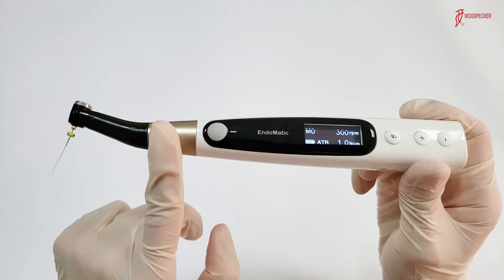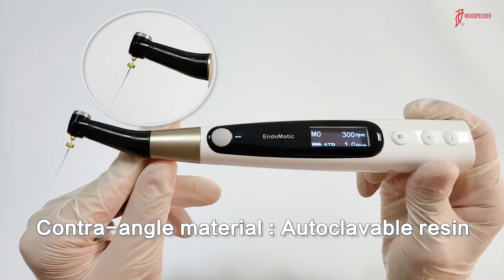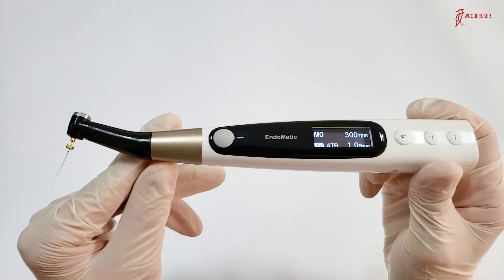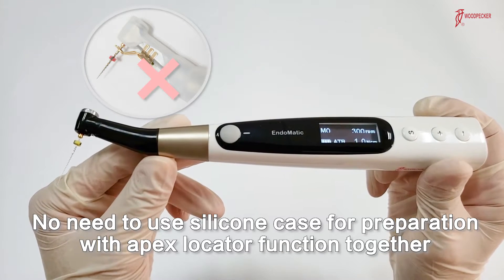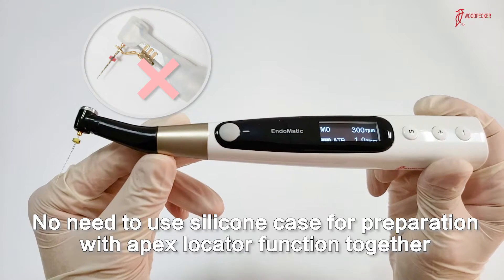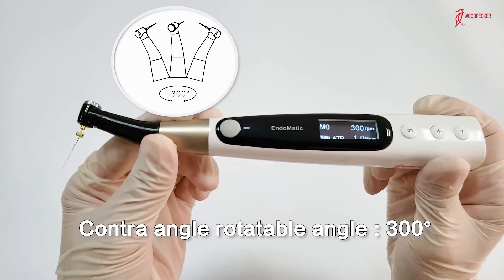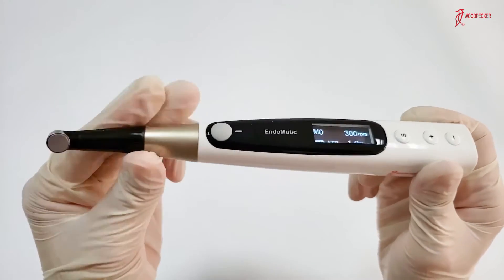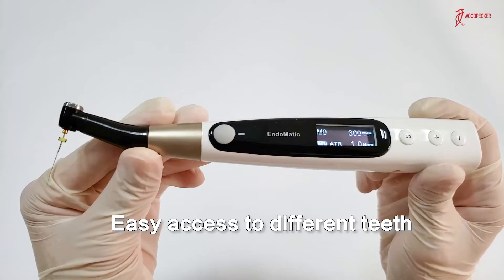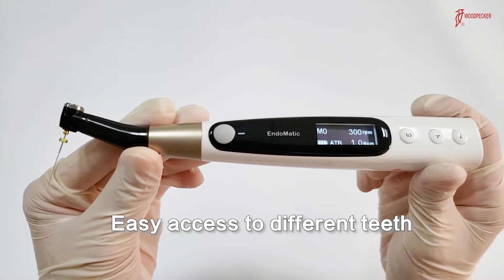First, let's look at its contraangle. It's made of autoclavable resin, so for preparation with the Apex Locator function, there's no need to put on a silicone case. This contraangle is 300-degree rotatable, so it's quite convenient for different case preparations.